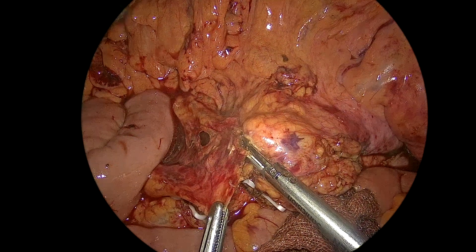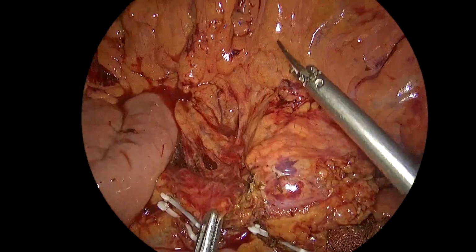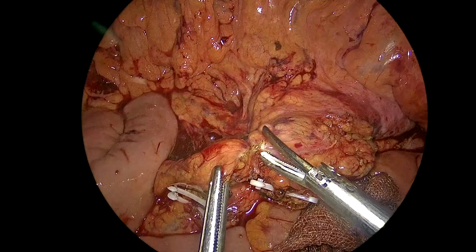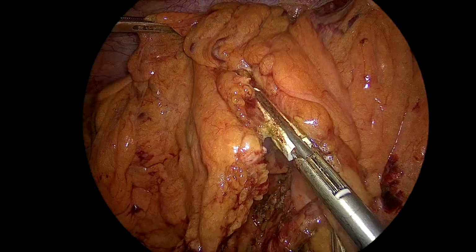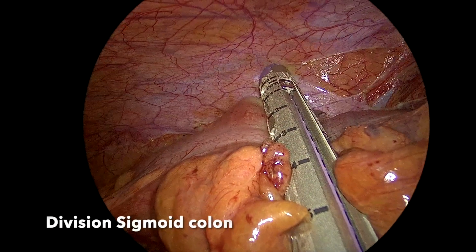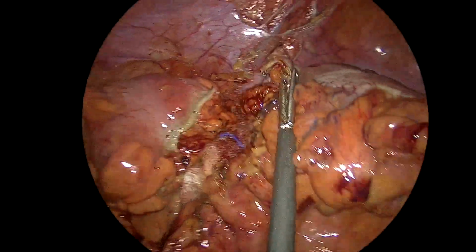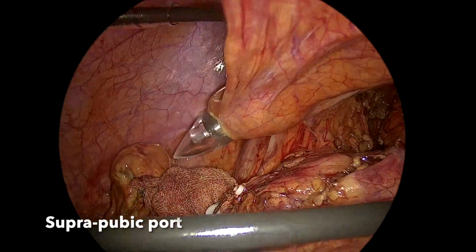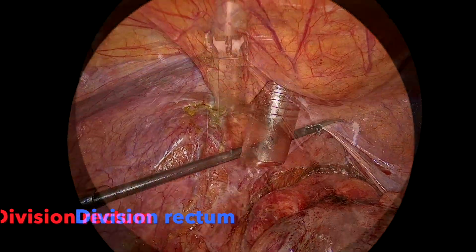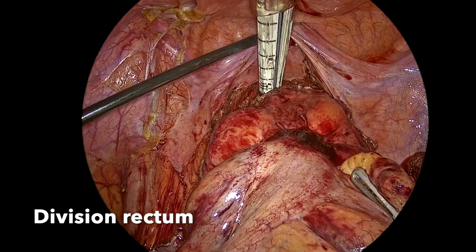The proximal point of transection should be one that is well perfused, reaches the pelvis without tension, and satisfies a 5 cm margin from the tumor. The sigmoid colon was divided by NGIA 60 mm intracorporeally. A suprapubic port was made and an Endo-GIA inserted for rectum division. Endo-GIA was applied.